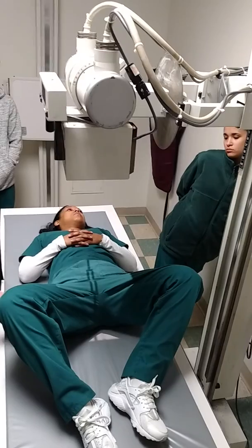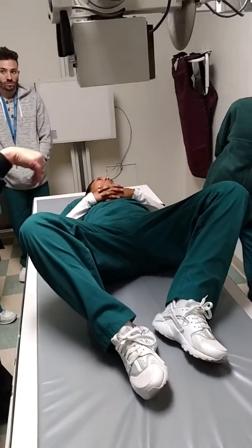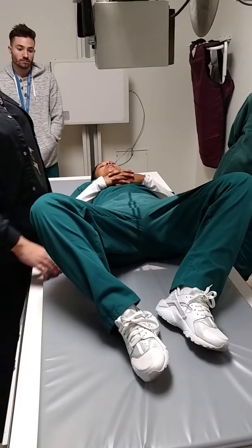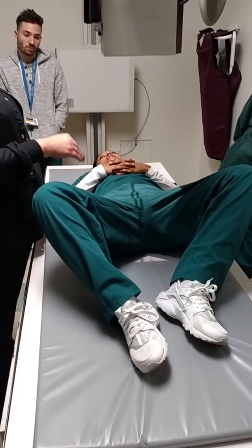She's got room over here. Hold your breath. Beep. So this is a lateral of both hips. Posterior obliques. Axial outlet and then AP axial inlet. It's an AP projection, but it puts the hip in a lateral position.